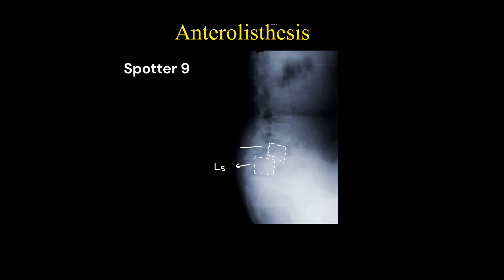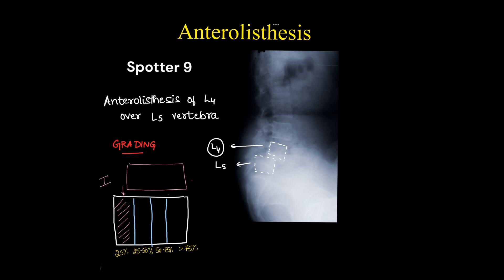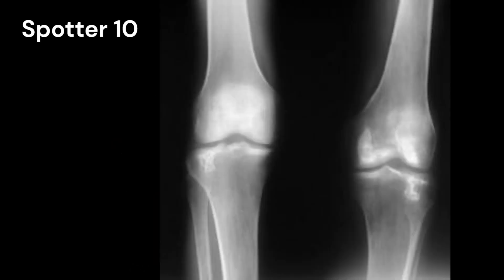This is anterolisthesis of L4 over L5. The superior vertebral body is always taken as the listhesis over the inferior. In grading, the lower vertebral body, that is L5, is divided into 4 parts: 25%, 25-50%, 50-75%, and above 75%. If the upper vertebral body is displaced within 25%, it is grade 1; 25-50% is grade 2; 50-75% is grade 3; and above 75% is grade 4.